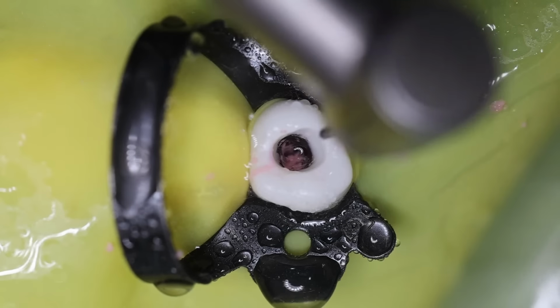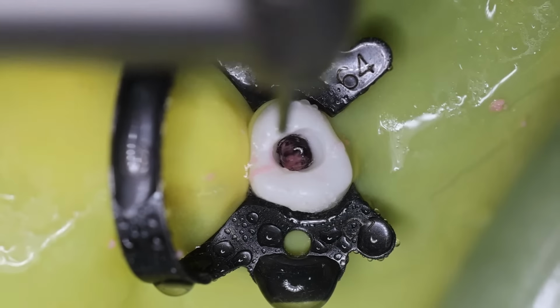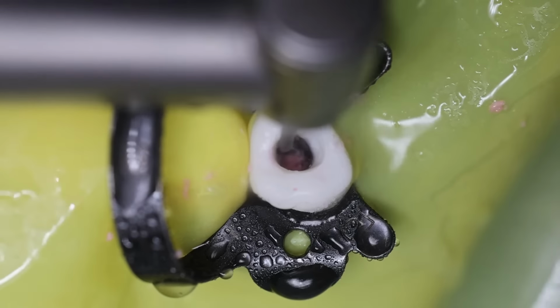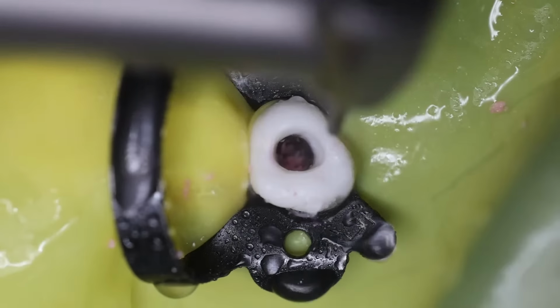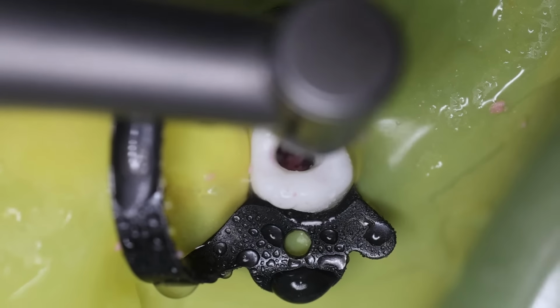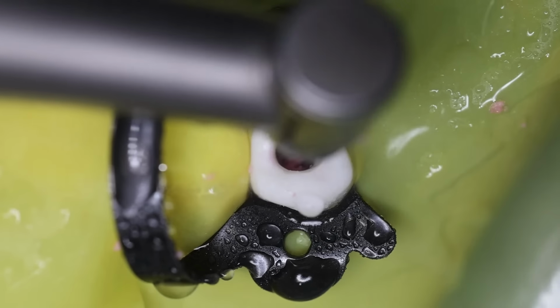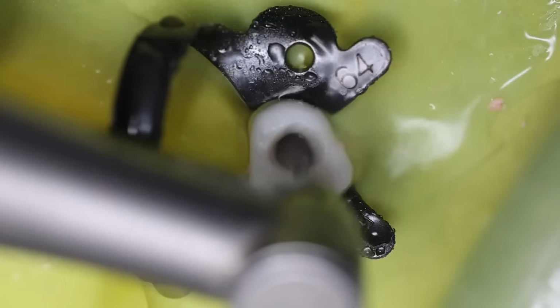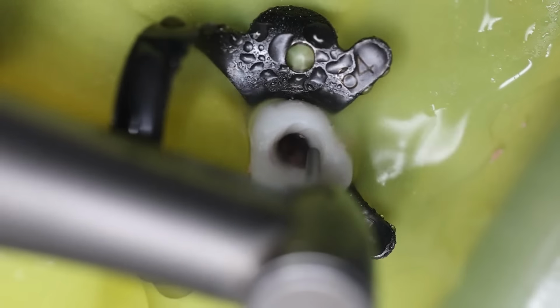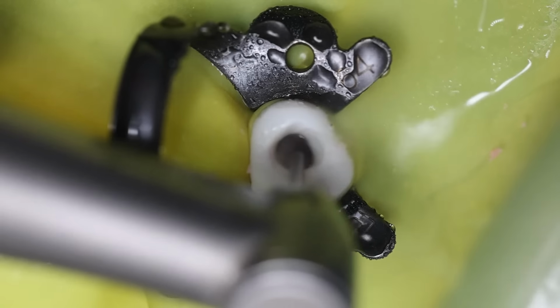The idea behind this is that we are removing the coronal pulp that is assumed to be infected. That is the only point over here. And our cavity should be visibly wide.